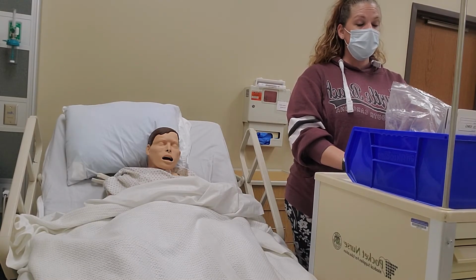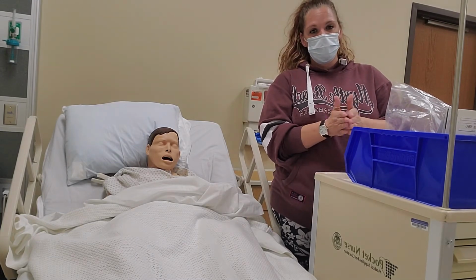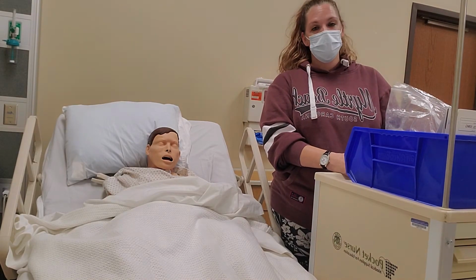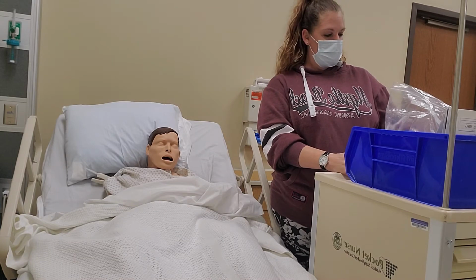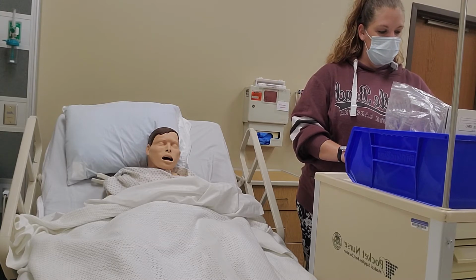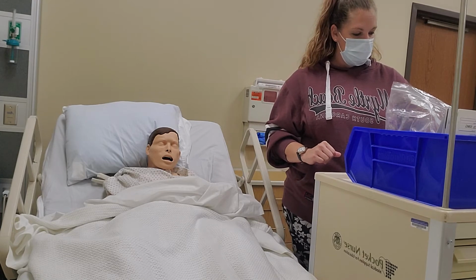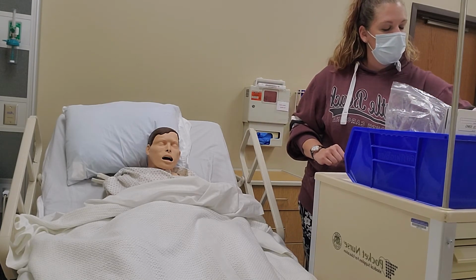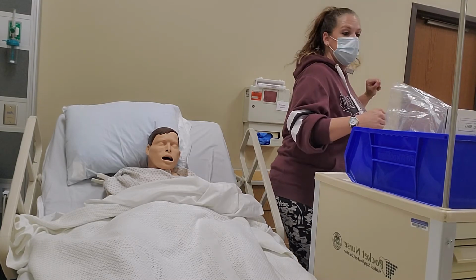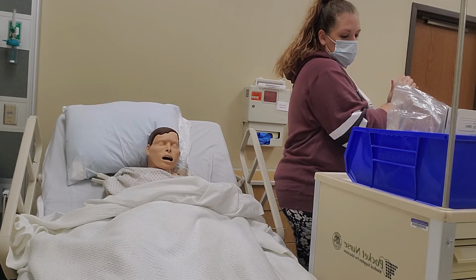For your NPH, you would want it cloudy. If it is not cloudy, roll it. If it does not mix up and become cloudy, you need to call the pharmacist and get a new vial. Okay, so we are going to give it into his abdomen. And I'm going to go ahead and do some more hand hygiene just because I touched everything. And I'm going to get some gloves.